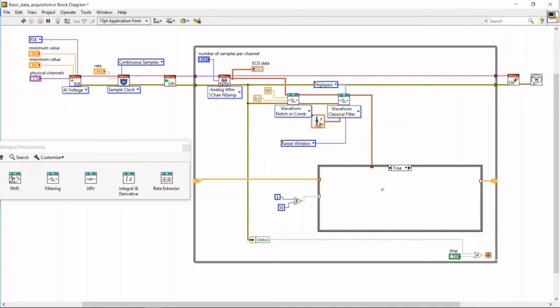So next thing to do is actually calculate this heart rate. So first, all we're going to do is shift that window of 1250 samples as the samples arrive. So in each iteration, we are going to take the first 25 samples and put the next 25 samples.